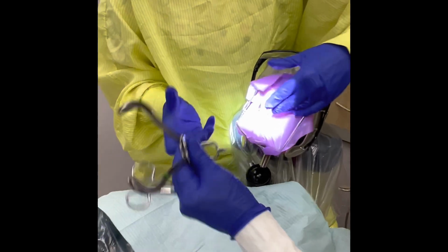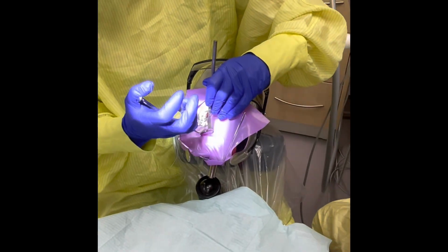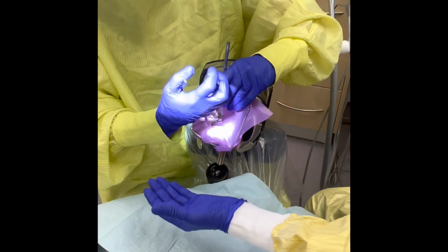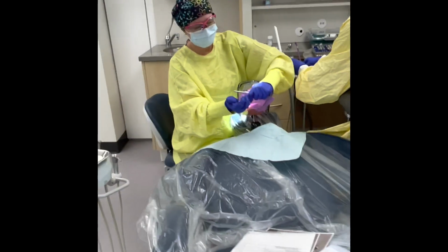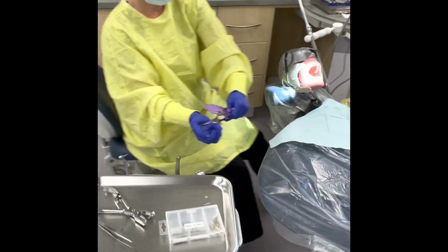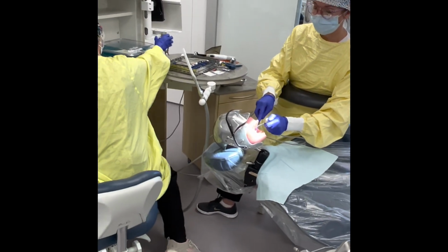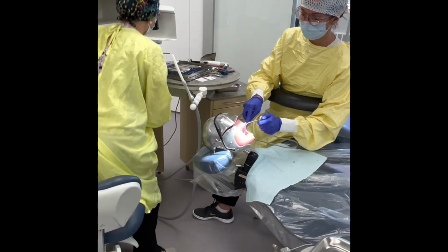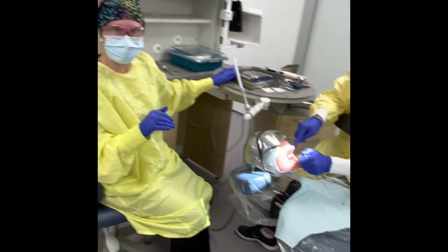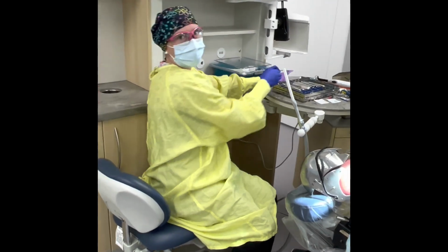Pass the scissors back, and Stacy's got my forceps and my mirror. What I'm going to do is take the whole unit off, come around to my side, and Stacy's going to give the client a full mouth rinse. While Stacy's doing her full mouth rinse, your operator will take a look at the dental dam and ensure that it is intact, okay?